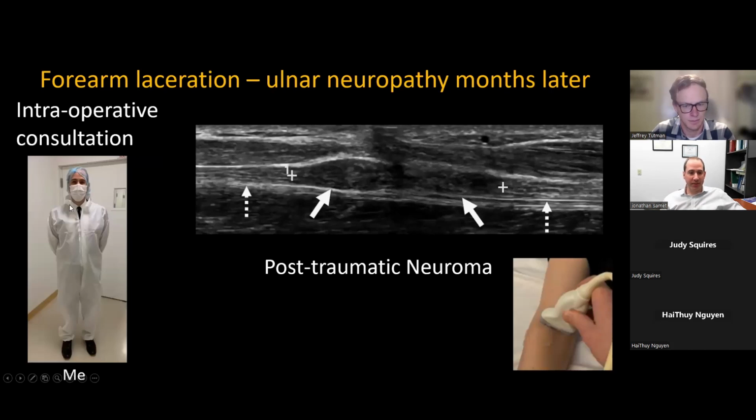And what I also do, this is me here, I will then offer myself to go to the OR. So for example, this is another way you can start up your practices, is if you talk to your peripheral nerve surgeons and you offer this, they're very happy because they previously didn't have anyone to image their studies. This is just a very tricky area. They do the EMG, the nerve conduction studies, but what they want help with is where is the actual neuroma, right? They know that the electrical abnormality is somewhere in a certain area, but if you can show them where the actual nerve injury is, they can limit their incision, they can limit the OR time.